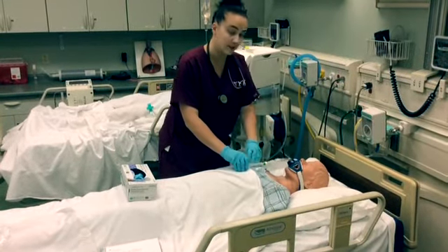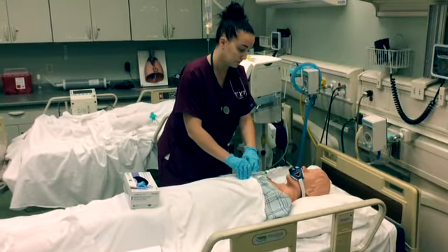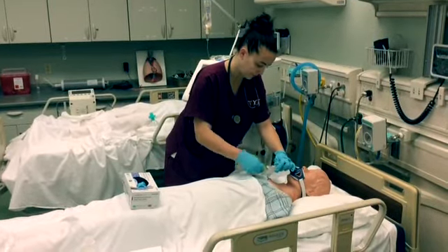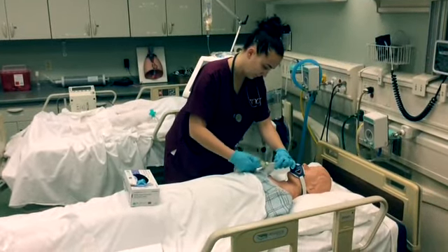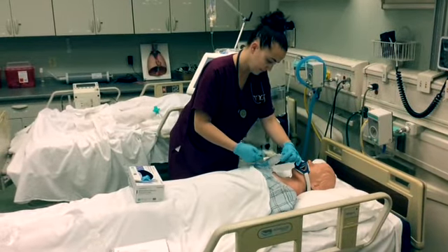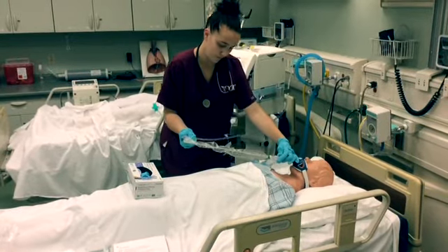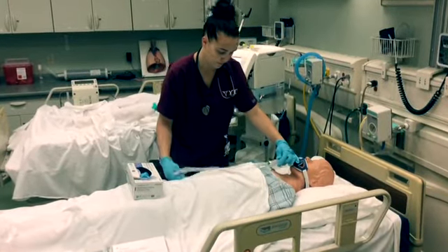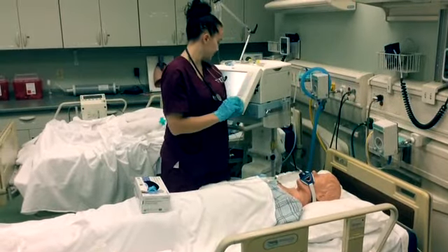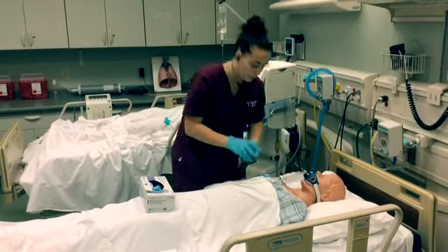You're going to give them about 30 seconds here. And then we're going to do it again. Again until we meet resistance. Squeeze and pull. We're going to hyperoxygenate again. And we're going to assess them again and see if we got any of that out.